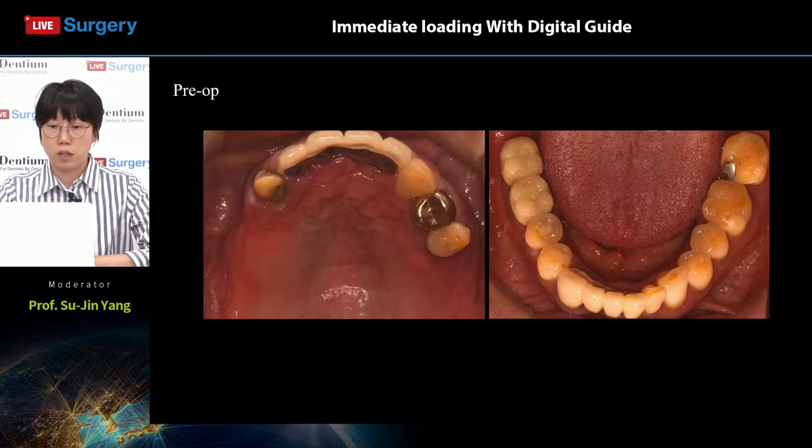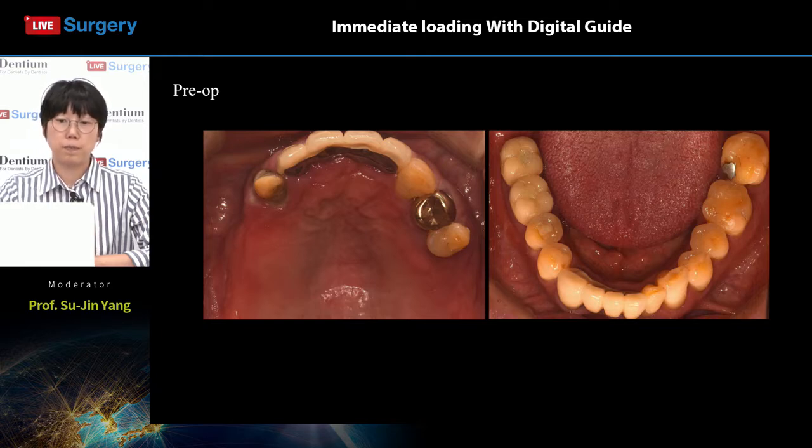patient. No guidance from anterior coupling always has a bad influence, worsening the posterior interference and leading to a poor prognosis of the final prosthesis. This can be especially critical in implant prostheses because implants are very vulnerable to lateral forces. Even with improved implant surfaces and fixture designs, it is still important to have such prosthetic concepts in mind during the whole treatment procedure for more promising results.